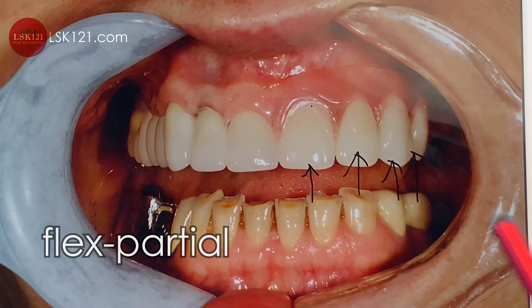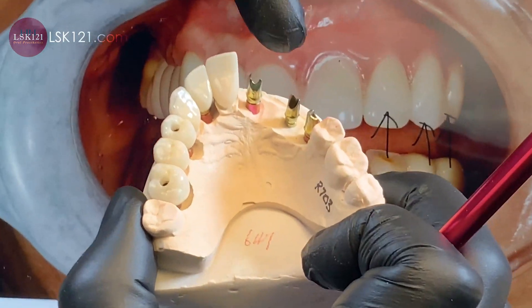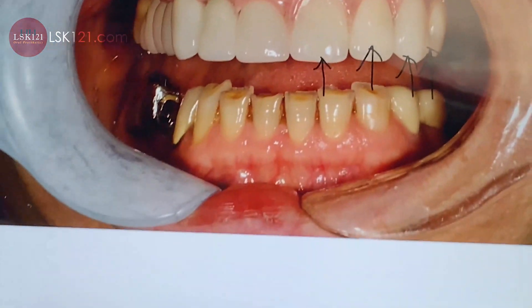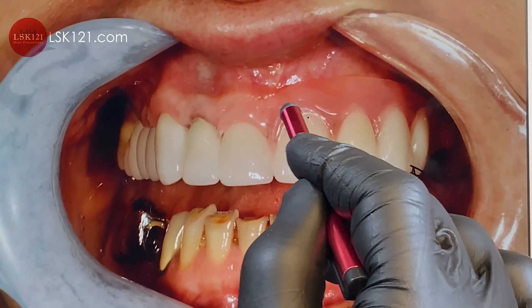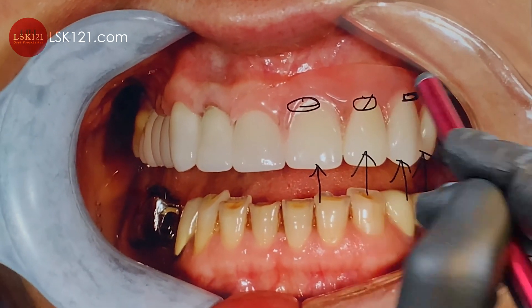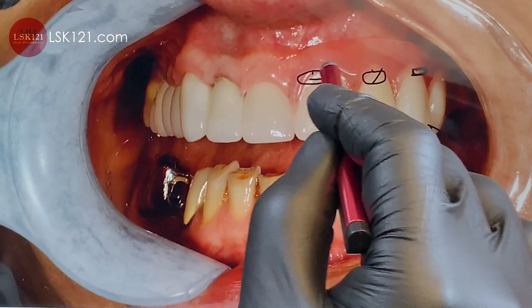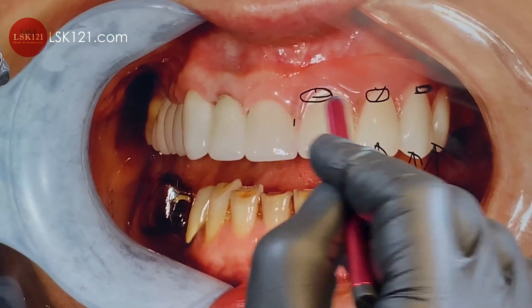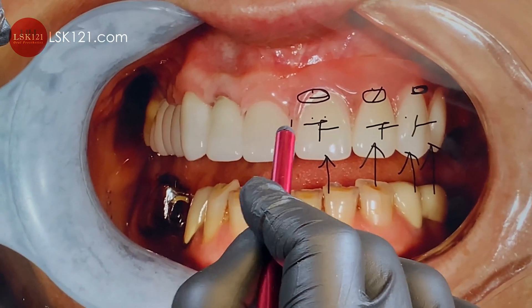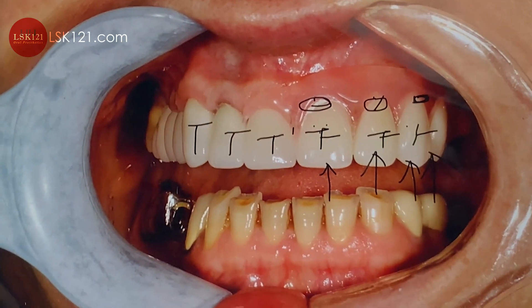We fabricated a flex partial for this case. The doctor placed implants on one side — positions one, two, three — so the patient has no teeth there, only healing caps. They have to seal it for about three to six months, so we give them the flex partial as a temporary restoration.